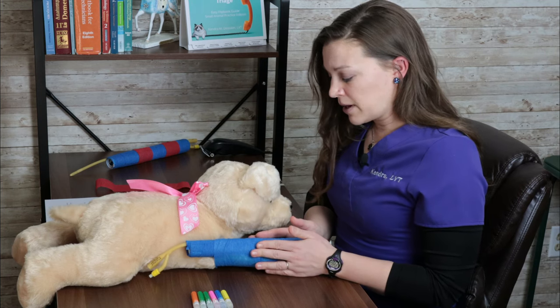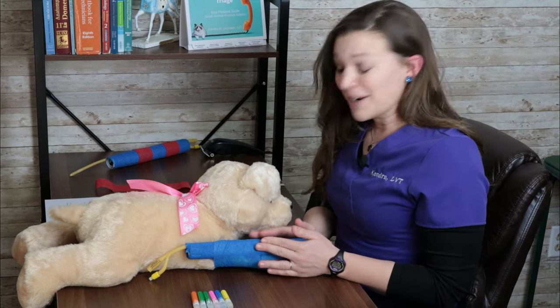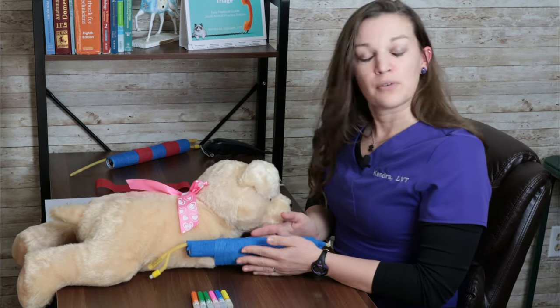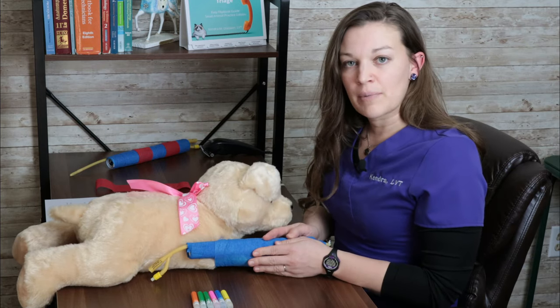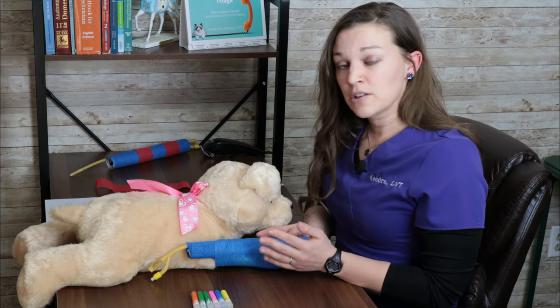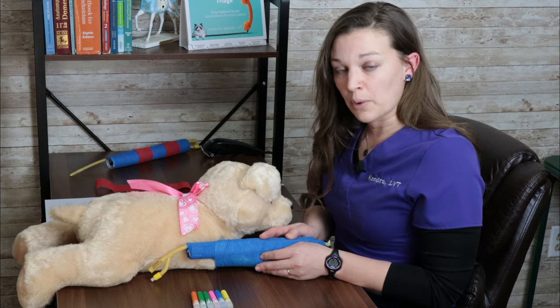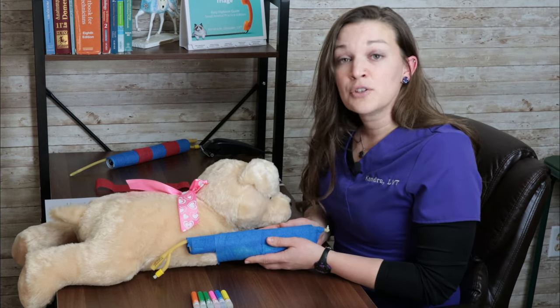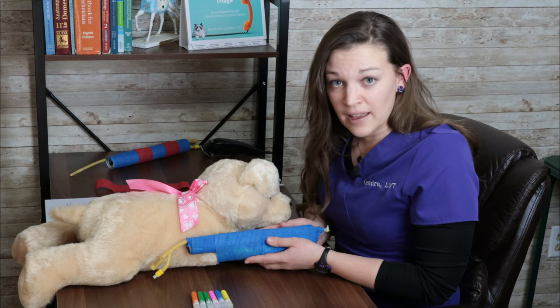The next step that we want to do is to clean the area. I'm not going to get Penelope wet since she is a dummy, but usually we'll do 3 and 3 with chlorhexidine scrub and alcohol. There are some other theories and different ways out there, so use whatever your hospital or school protocol is. Once you've cleaned the area, don't touch it again.